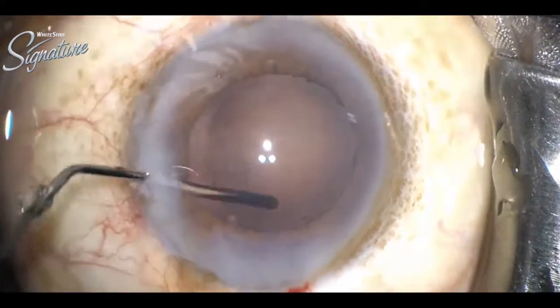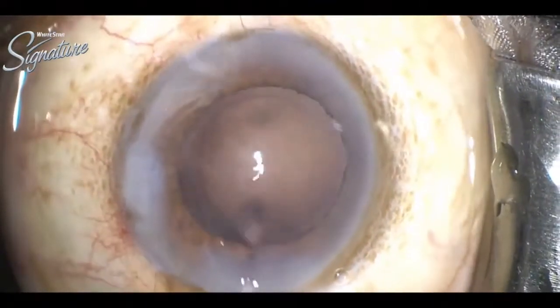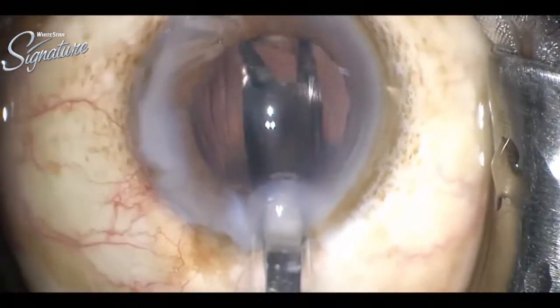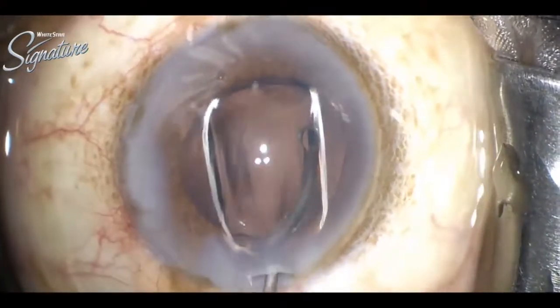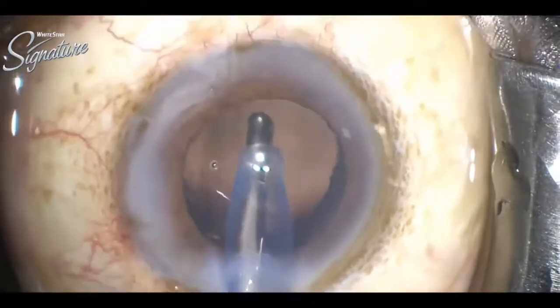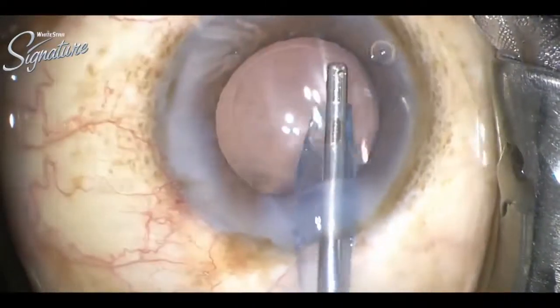The chamber is filled with viscoelastic, then the foldable IOL is injected. As it unfolds, the chamber is cleared of the excess viscoelastic. You can see how the lens is well centered and the AC is well maintained.